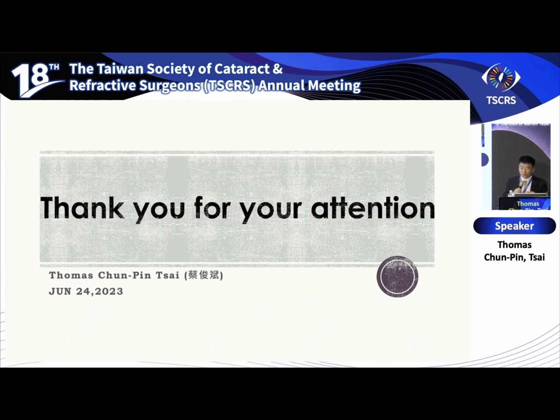Okay, thank you. We all know that my default for RK patients is just a monofocal IOL. But this patient said he needs to use a computer and read papers. So he wants some EDOF effect. And we all know that if we give a traditional diffractive multifocal IOL, it causes many halos and glare in an already multifocal cornea.